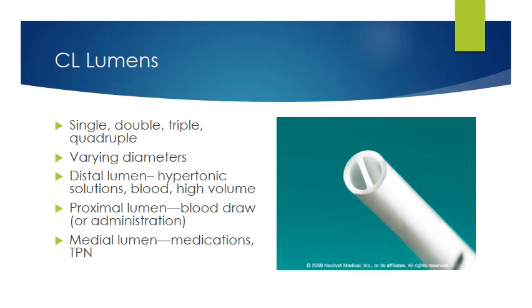This is a double lumen, and can you see the ports? You could have 4 different medications infusing if it was a quad, but with this double lumen you would infuse 2 different medications, and those 2 medications do not mix in the line itself. They don't touch each other.